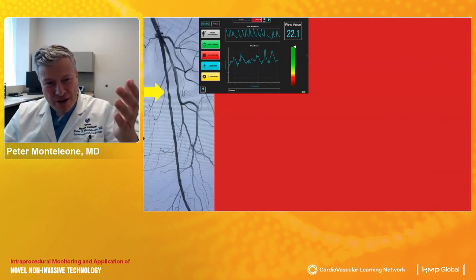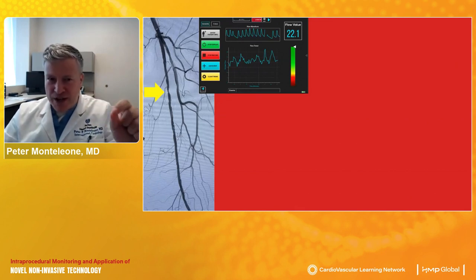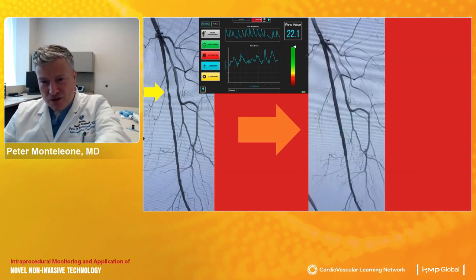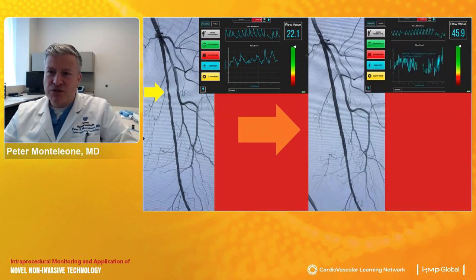And when you start thinking about treating this, you want to make sure before you've left the lab that you fix the thing that's actually going to help this person walk better. We did a very focused intervention on this, which was in fact a heavily calcified lesion, including atherectomy and a drug-coated balloon to prevent stenting in that segment. There's a little small area of dissection that you can actually see there, but when we look at the actual tissue perfusion improvement, it's dramatic. It's actually almost more dramatic than we saw in the SFA occlusion when you look at that flow value.